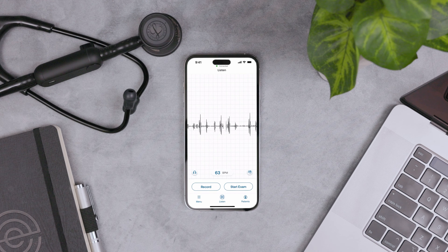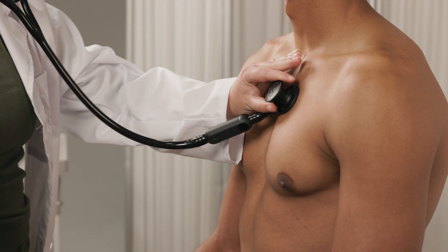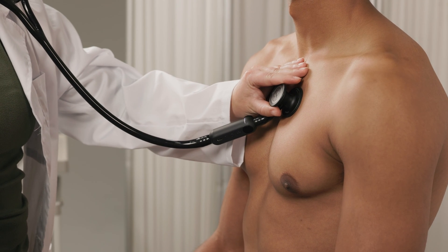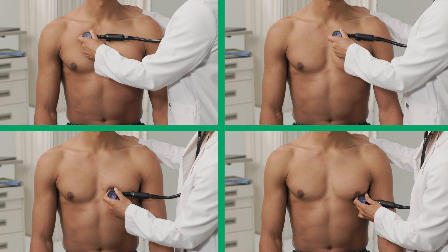Now let's take a tour of the Echo app. On the Listen screen, you can start listening to body sounds right after you open the app. This also lets you instantly visualize the PCG. At the bottom of the screen is the heart rate in beats per minute. If the rate can't be detected, two dashes appear instead. You can start a single recording for a range of body sounds, or take a guided four-point cardiac exam.